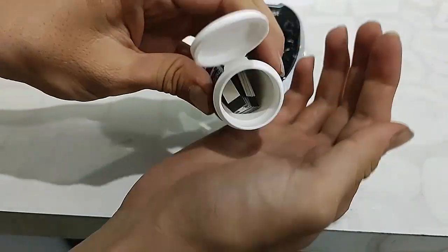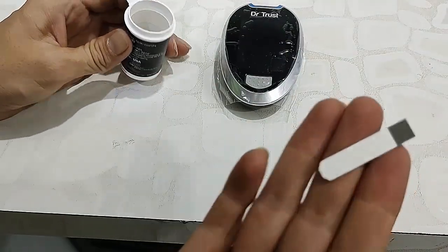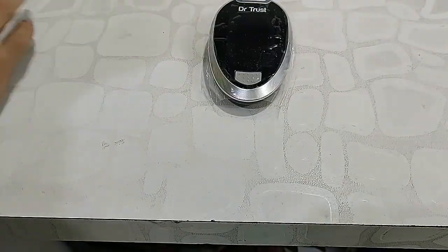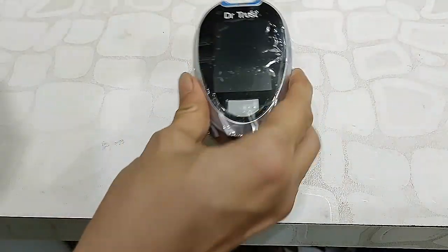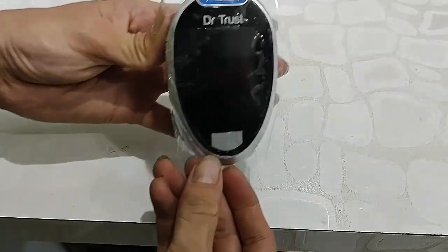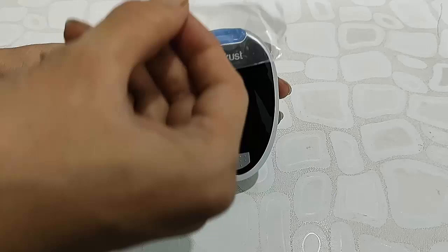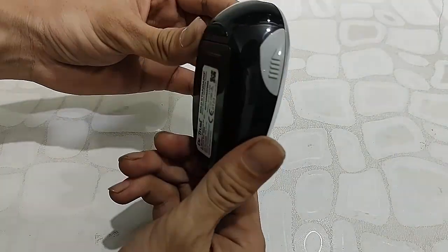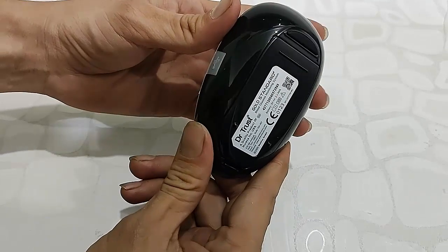These are the main test strips. Now the machine itself — this is the blood glucose monitoring machine from Dr. Trust. The build quality and finishing are good, and it has a big display.